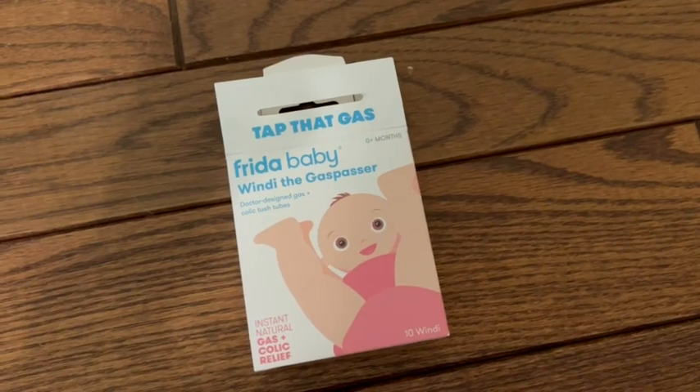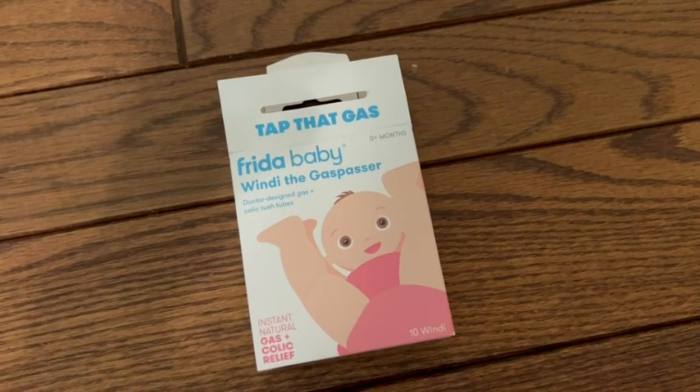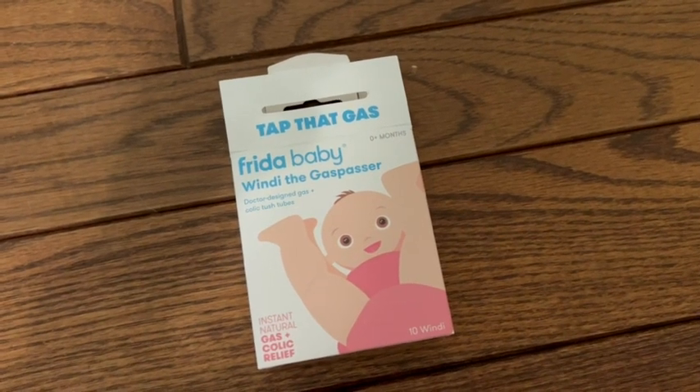Here I have the Frida Baby Windy the Gas Passer. They come in a set of 10 and they're okay to use on newborns and up.